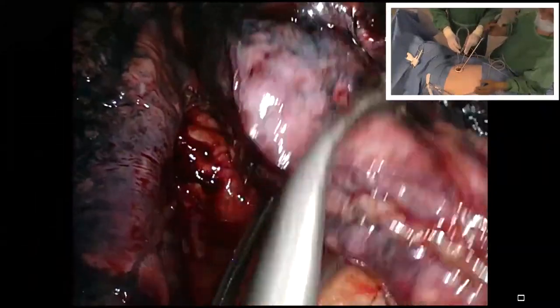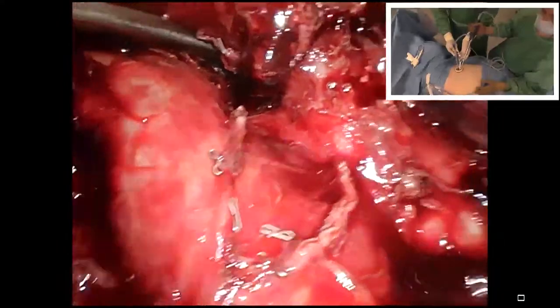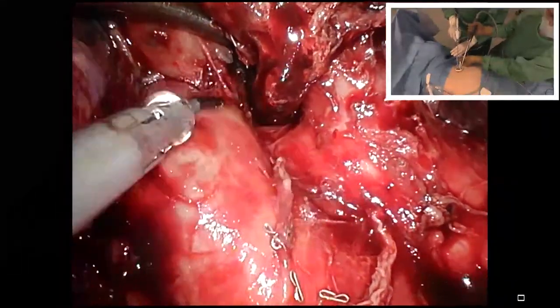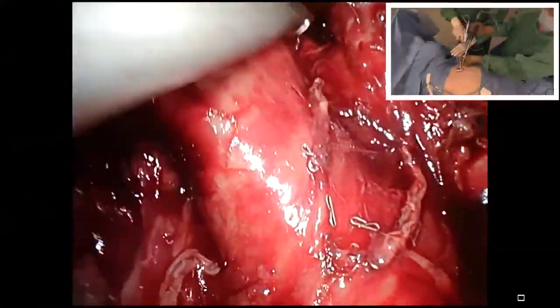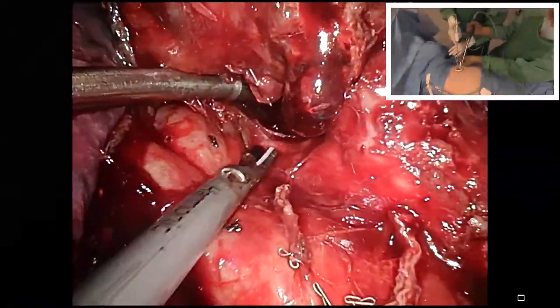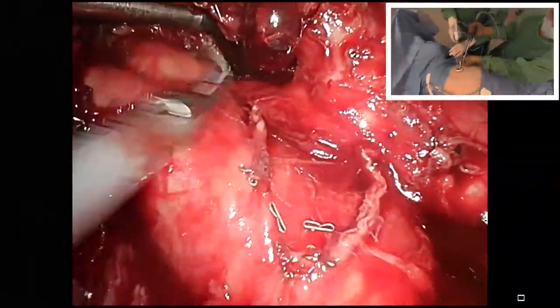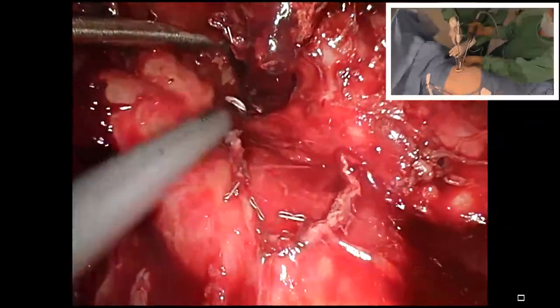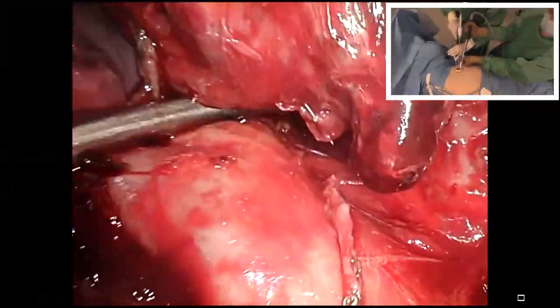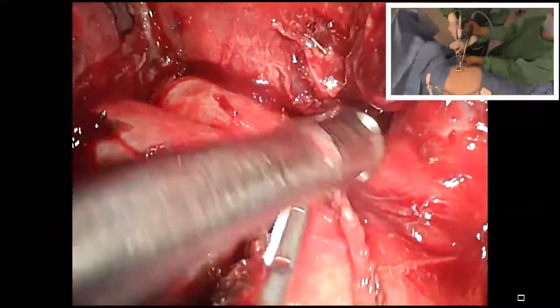What's the plan, Jens? The plan is to open this fissure here. Diego, the question was why don't you mobilize the lower lobe, the ligament, first? Because now I think it doesn't give an advantage. We just need to open the fissure here. That is the only thing we need now. Jens, if you release the ligament, I think in this step it is a waste of time. You should concentrate on this step in order to go forward. We will do it in a few minutes. But here is what we must do now. We just have some suggestions and we follow, of course, what you do.